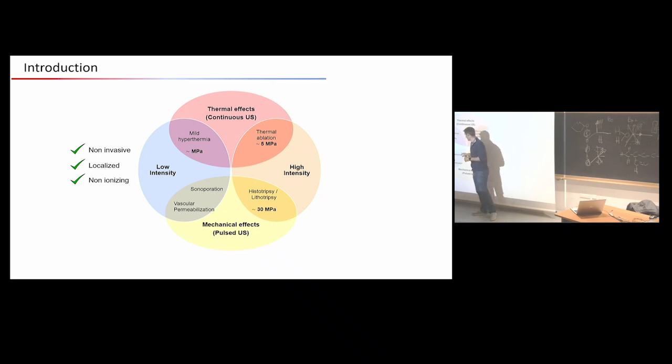And the one I'm working on is called sonoporation. This is drug delivery. If you use very low intensity with pulsed ultrasound, you will have what we call drug extravasation. So the main advantage of therapeutic ultrasound is that it's a non-invasive method. It's very focused, very localized, and it's non-ionizing.